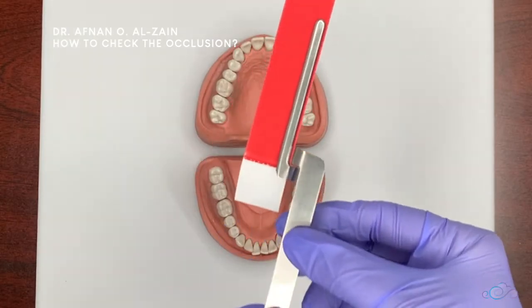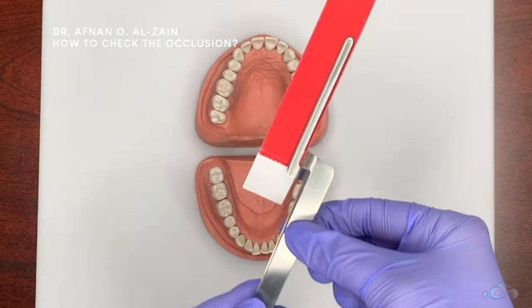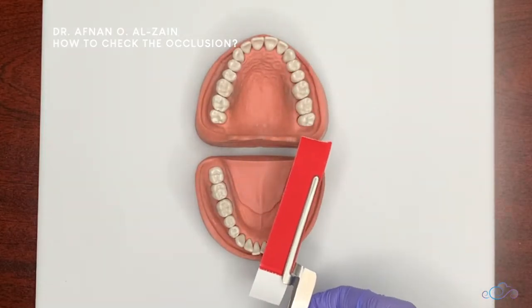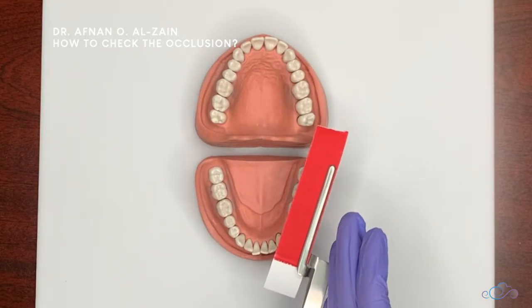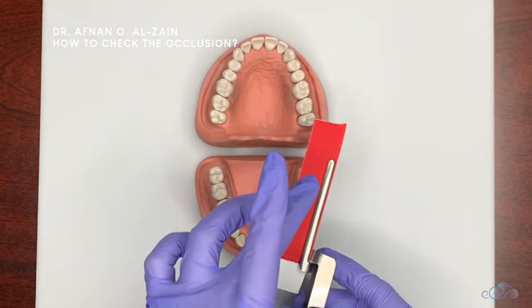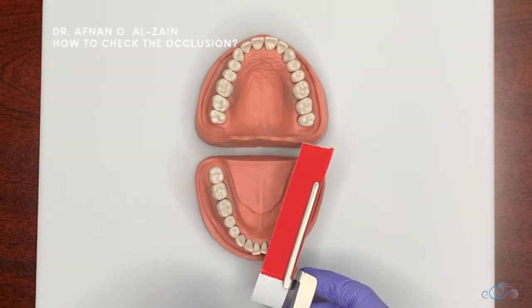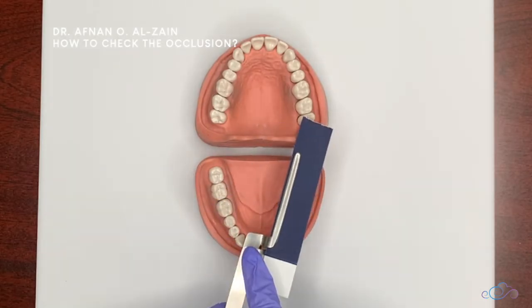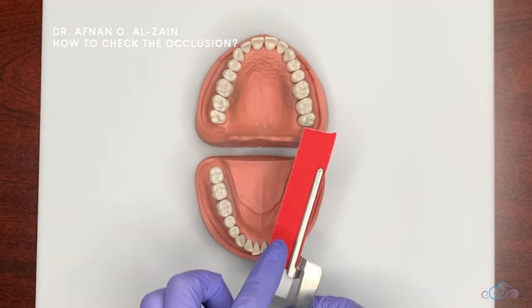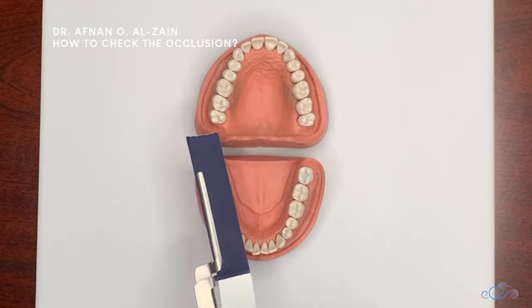To use it, place the handle of the holder in the buccal vestibule direction, so it is facing the buccal vestibule. That way the carbon of the articulating paper will imprint on the teeth. We do not hold it the other way because the patient would bite on the metal. This is the correct way, and the same applies on the other side.